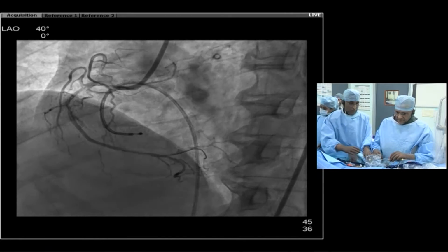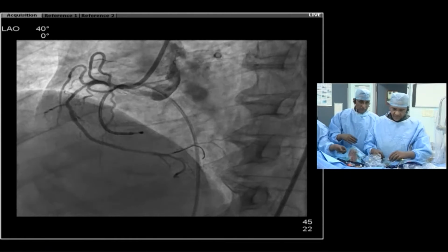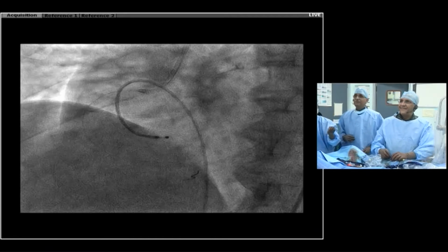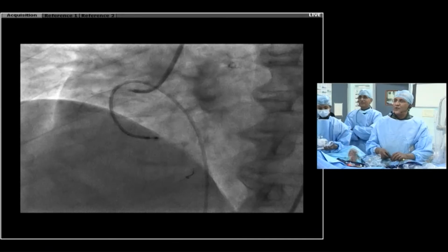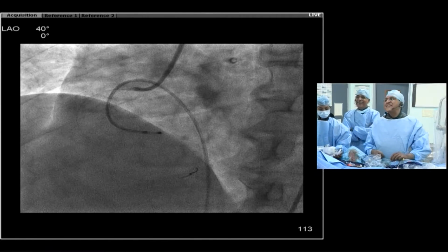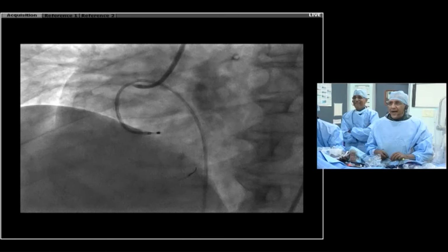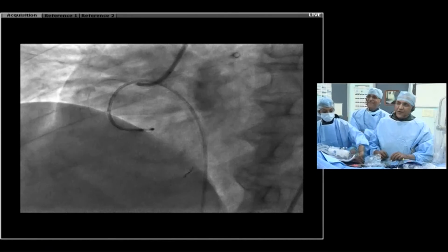Srinivas was mentioning the Rota Pro versus the Rota, and I can tell a very funny Paul Teirstein story. He said when they got the Rota Pro, he liked it. It was very easy because you could use your hand, but he couldn't figure out what to do with his right foot and how to put the foot on the table. So, you know, most of us dogs will do the same thing. But it's interesting that I've not used the Rota Pro, so I really am waiting for all your experiences. I've not used a single Rota Pro yet.